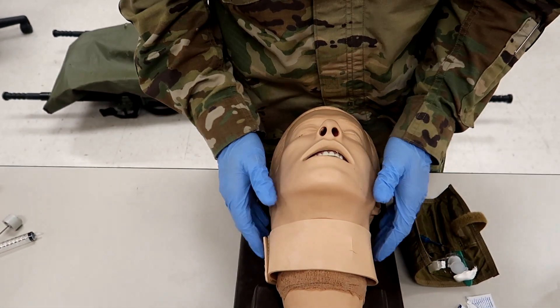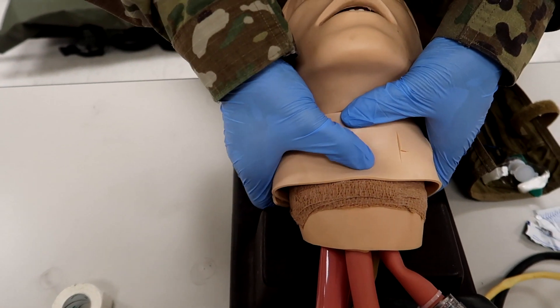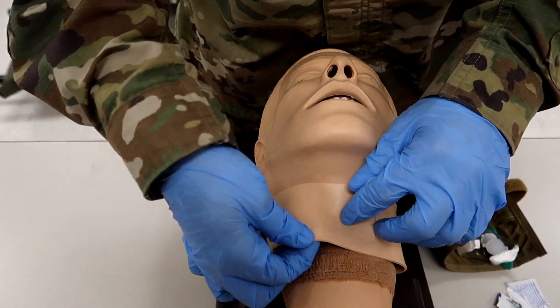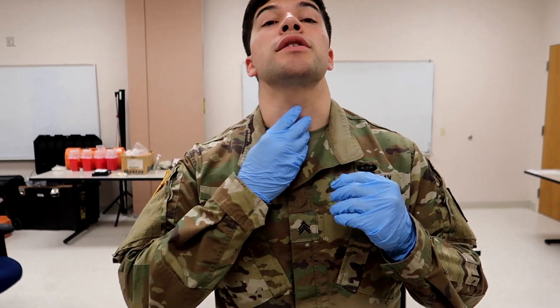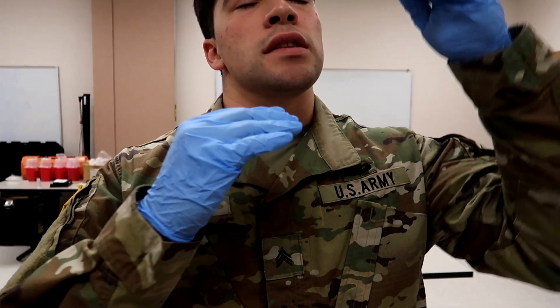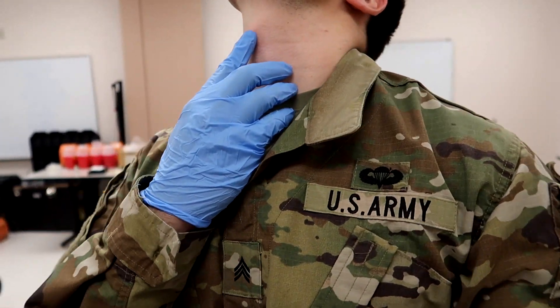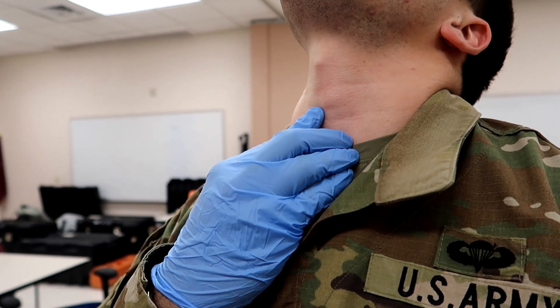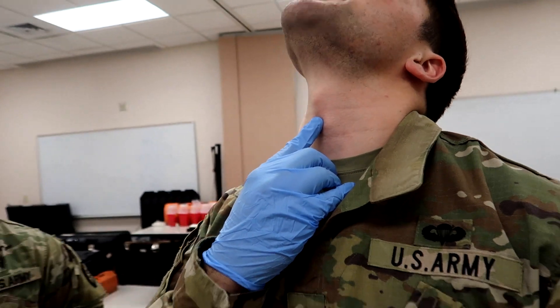Next, he's going to identify the cric membrane between the cricoid and the thyroid cartilages. So he's located his site. Whenever you look at the cricoid membrane, you're going to look for the Adam's apple and start going down. You're going to notice a little dip and then it's going to come back up — that little dip is where we're going to be cutting into. That's where the tube is going to be going.